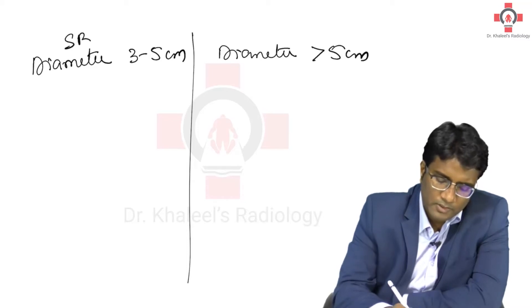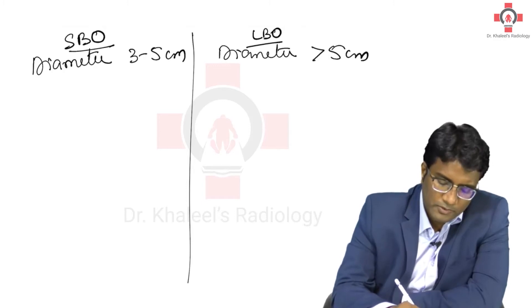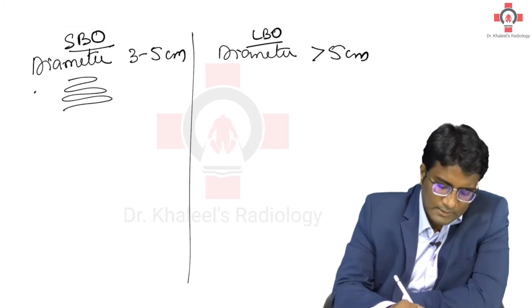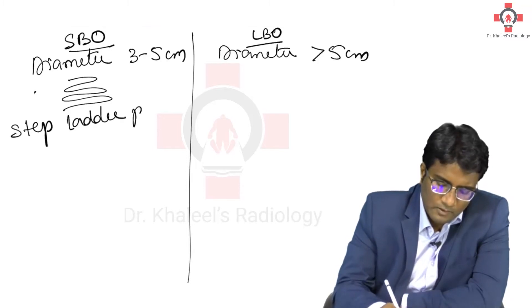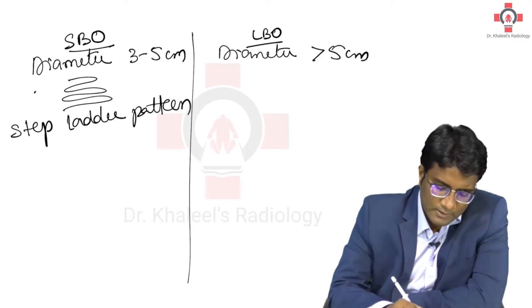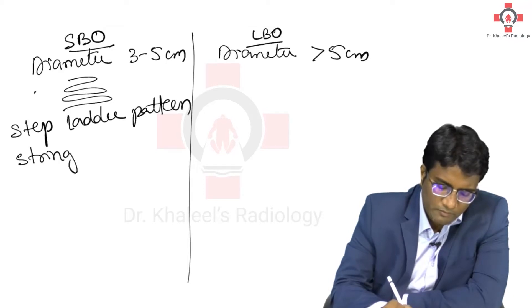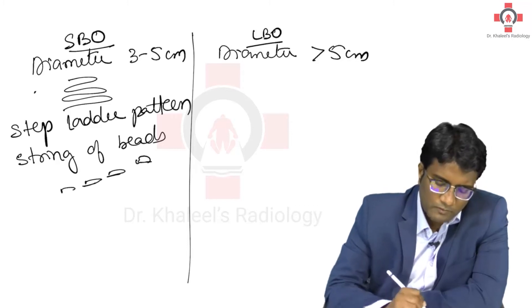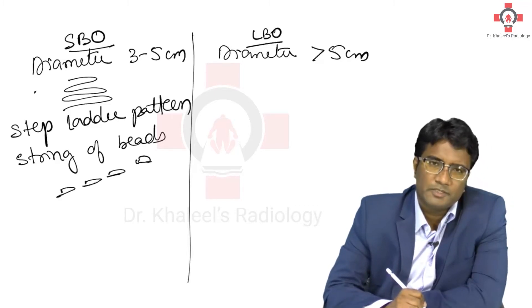In small bowel obstruction, because the bowel loops can be present one above the other, you get a step ladder pattern. You can also see multiple air fluid levels giving a string of beads appearance, where multiple small bowel loops form a string of beads.